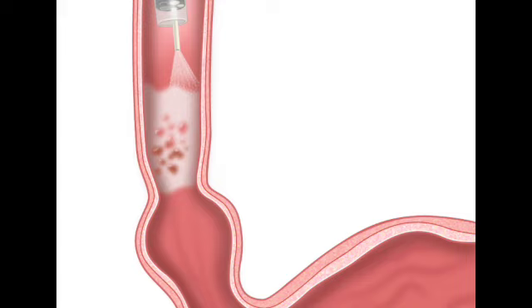Aside from some temporary irritation resulting from the use of the dye specifically, the source notes a patient might experience mild esophagitis or gastritis. Which is what exactly? It's simply a temporary inflammation of the esophagus or stomach lining. Oh, okay. So aside from that, there are absolutely no major serious side effects. There are no severe adverse events linked to using acetic acid this way.